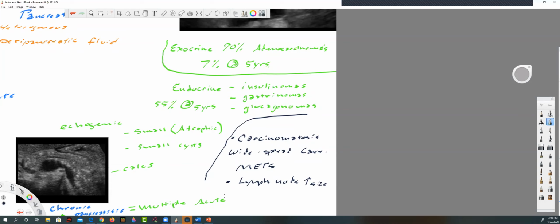But then, just like the pelvis, you have a mucinous cystic adenoma. And just like in the pelvis, these are larger cysts. Now, your book says greater than 2 centimeters, and then I think on the last page or something, it says 5 centimeters, as if 5 centimeters was a requirement. But in any case, larger cysts. And if they're mucinous, they're probably going to have some echoes inside of them, because mucin is not completely clear, or anechoic, I should say, on ultrasound. So mucinous cystadenomas are a possibility.